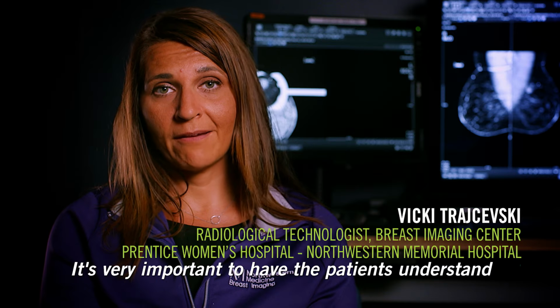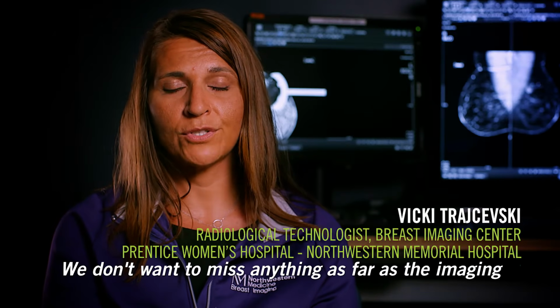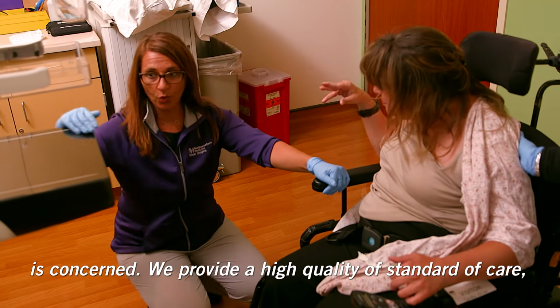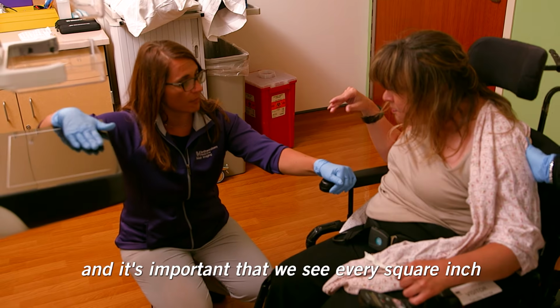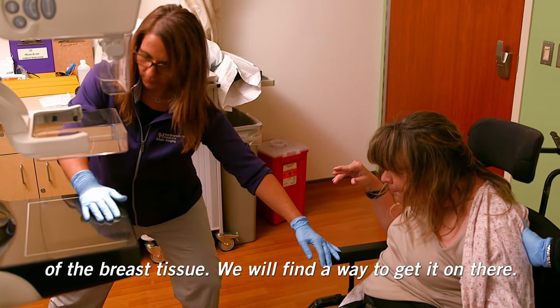It's very important to have the patients understand the need of a good mammogram. We don't want to miss anything as far as the imaging is concerned. We provide a high standard of care, and it's important that we see every square inch of the breast tissue. We will find a way to get it on there.